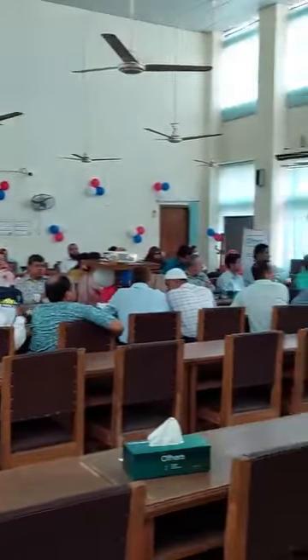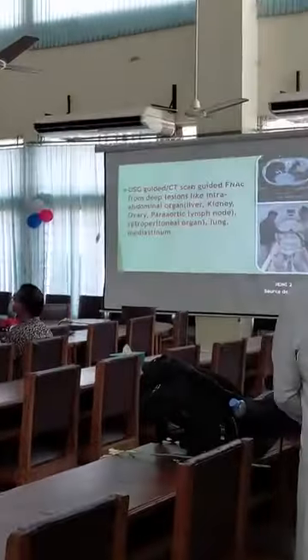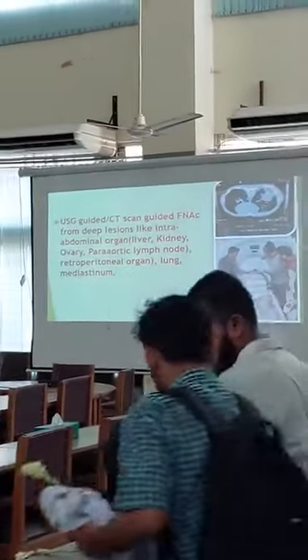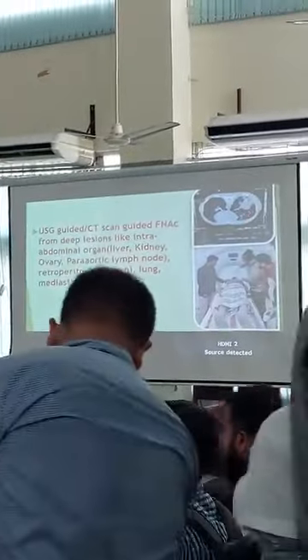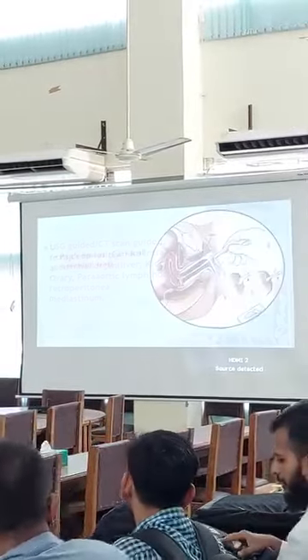This is ultrasound-guided or CT-guided FNAC from deep lesions like intra-abdominal organs or lung and mediastinum. Here in this picture, you can see the CT-guided proper localization of the nodule, and the needle is properly visualized within the nodule, after that aspiration of the material.